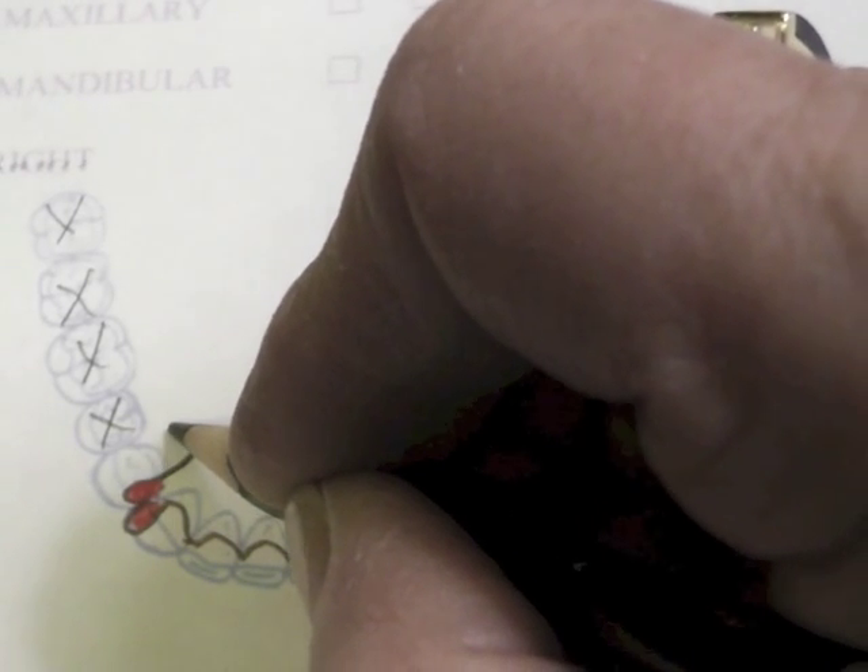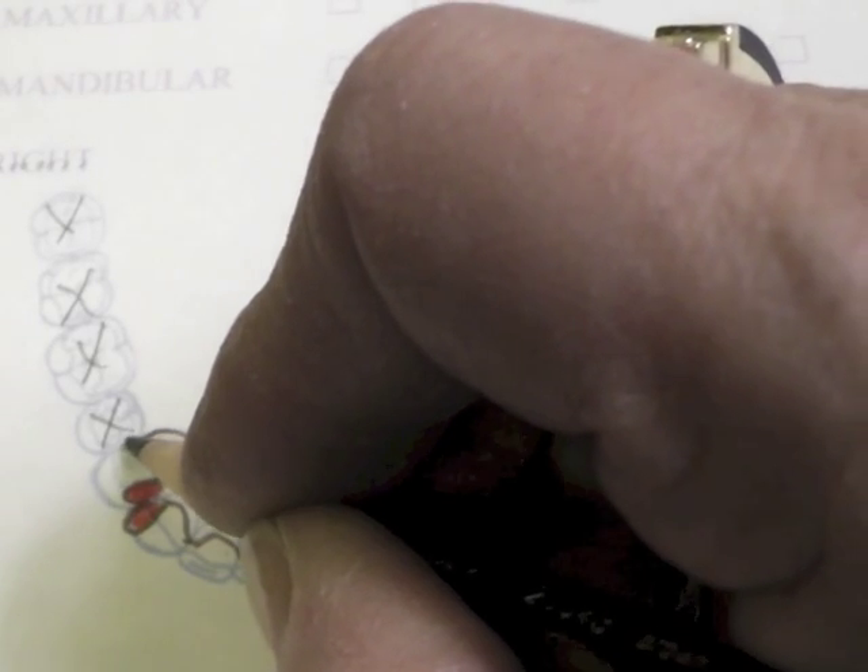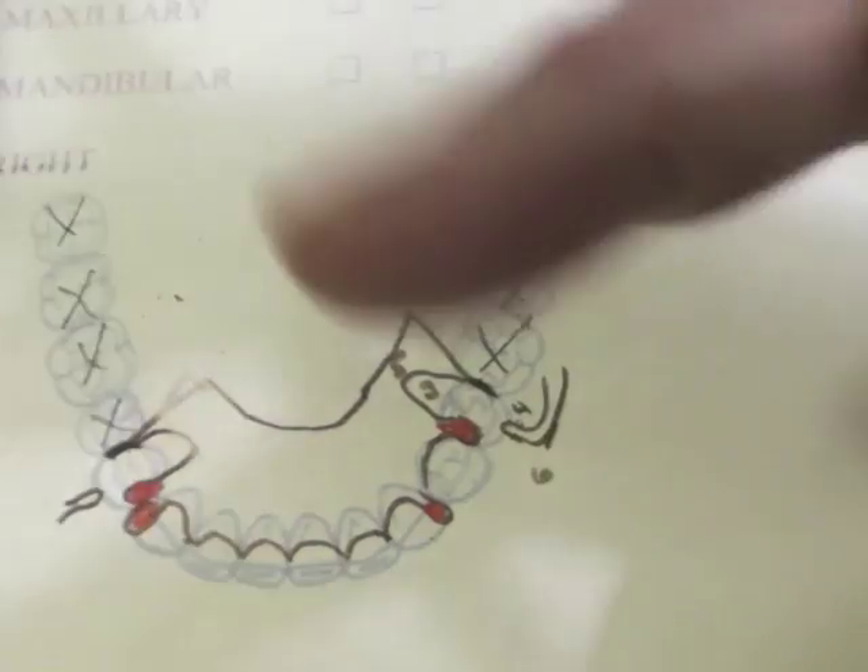We'll come around this tooth. It's going to come down, avoid the marginal gingiva by three or four millimeters. It's going to come back up and be a guide plate that encircles the tooth a little bit to its smaller size, therefore trapping the tooth from moving to the lingual. I'm going to slant that major connector a little bit more to the distal, and we need to show there's a minor connector there as well.